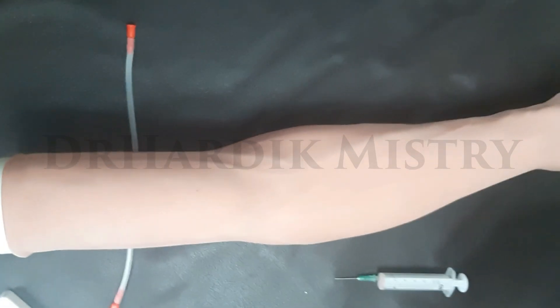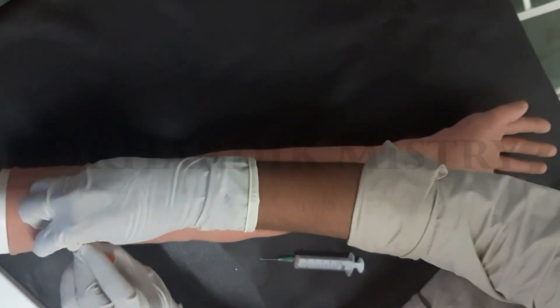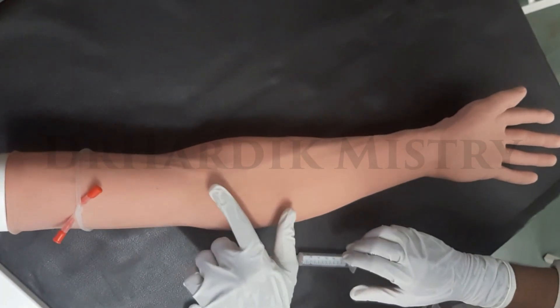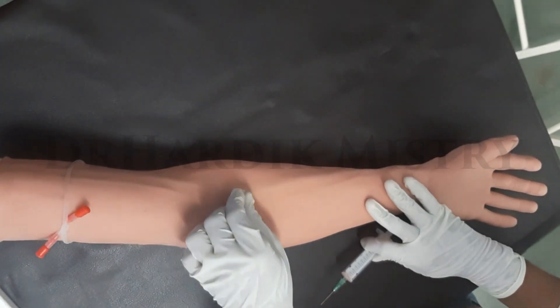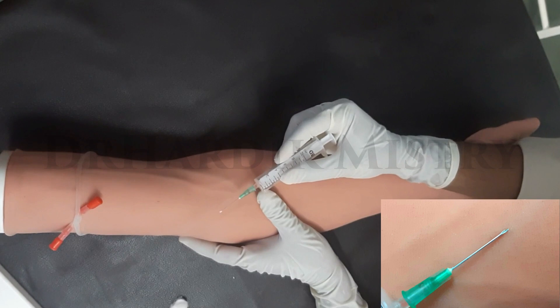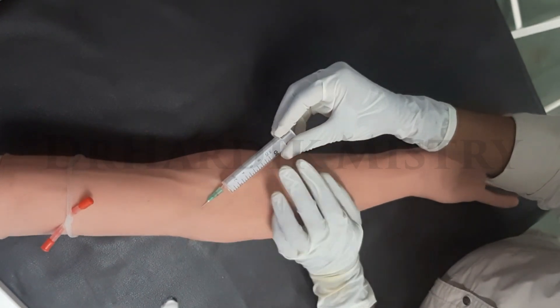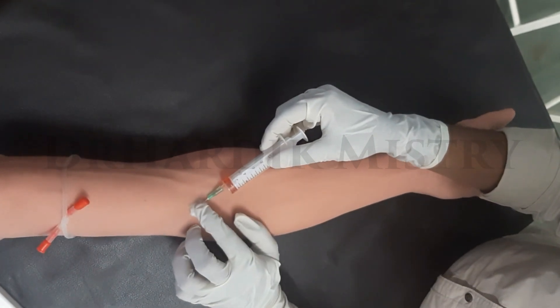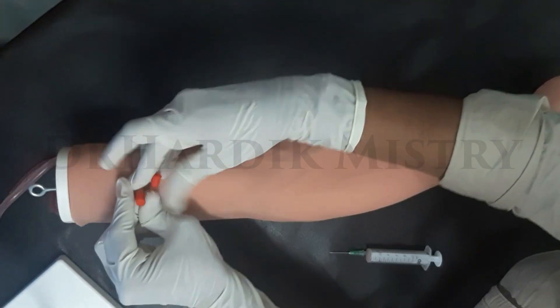Tie the tourniquet just above the cubital fossa. Palpate the anticubital vein in the cubital fossa and apply a cotton spirit swab over it. Puncture the anticubital vein with the help of a needle while the bevel is facing upward. Collect the required amount of blood sample inside the syringe. Transfer the blood sample into the anticoagulant vacutainer. Release the tourniquet.